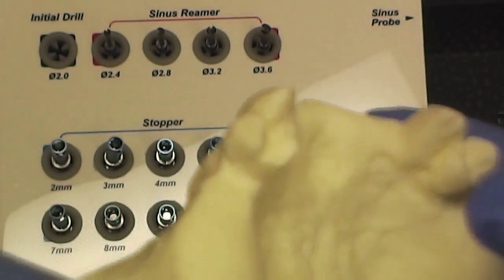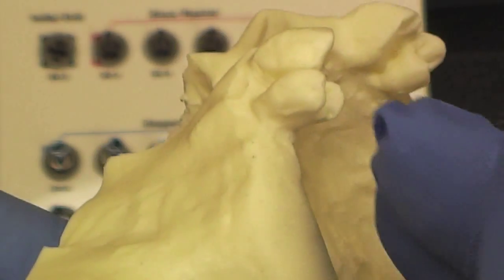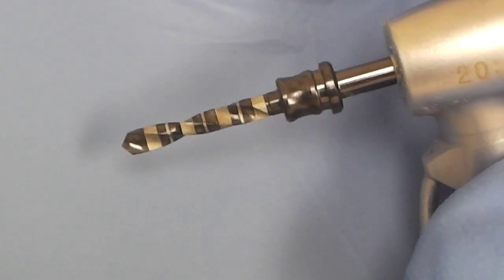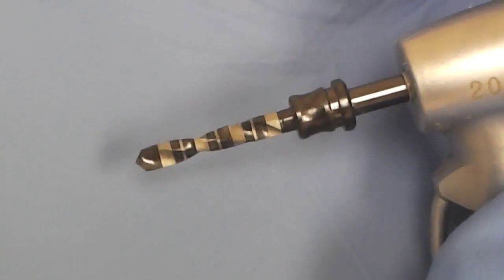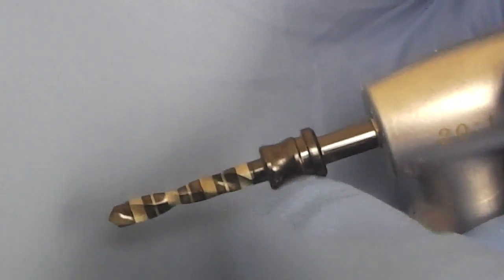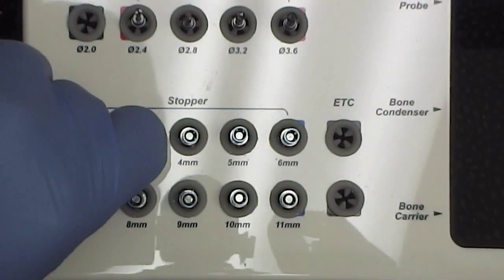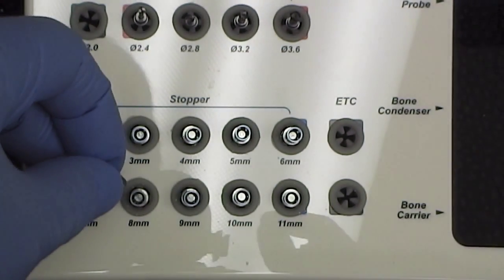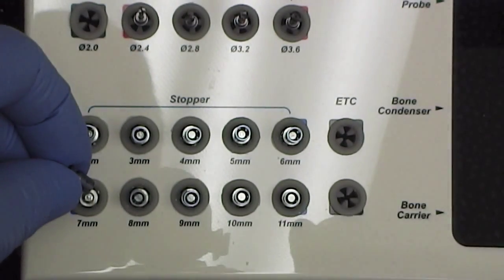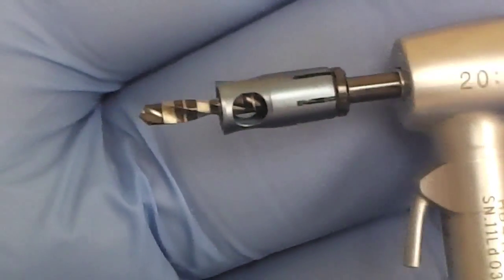What we're going to do is try to perform an osteotomy on this plastic teaching model in the appropriate position. We're going to start with the 2 millimeter osteotomy burr, and as you can see it has a clip for the drill stop on it. Because the estimated depth of the sinus here is about 9 to 10 millimeters, I'm going to start a couple of millimeters above just for safety purposes, and I'm going to use the 7 millimeter stop, as you see here.